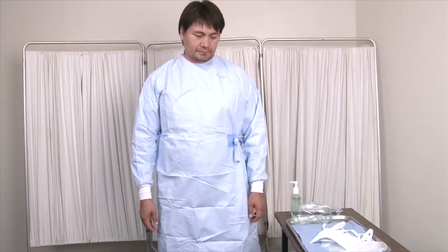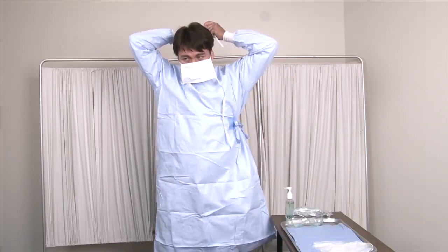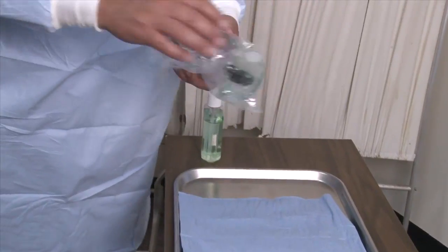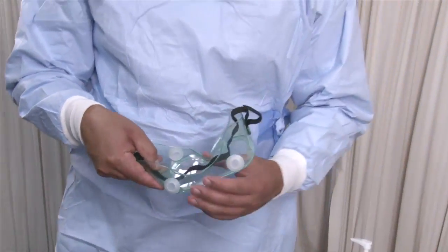Step 3: Put on the surgical face mask and press it to fit securely over the nose and mouth. Step 4: Put on the goggles, which should cover the eyes but not interfere with vision.